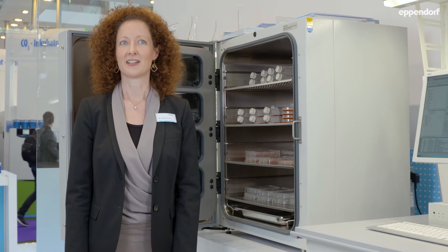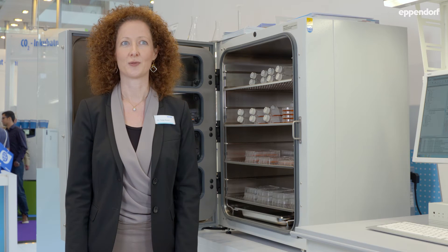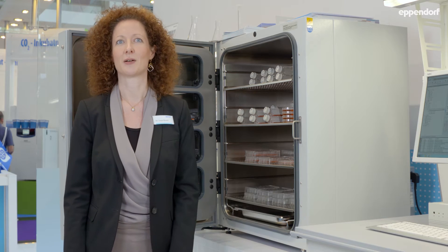We talked about homogeneous cell seeding and cell growth, and now within the third part of our lab tour I'd like to discuss the most important question in the cell culture lab with you: how to protect my cells against contamination. First, we should have a look at the potential sources of contamination. What do you think are sources for contamination?